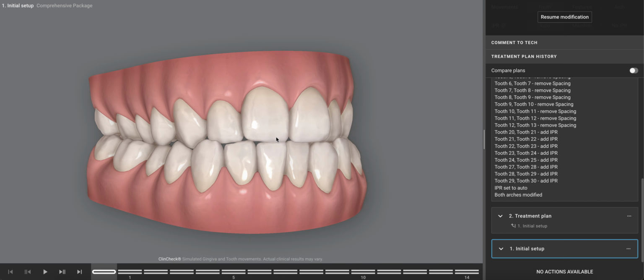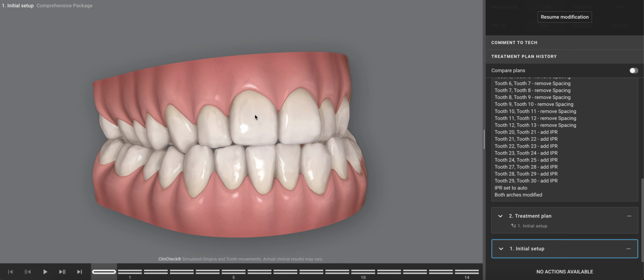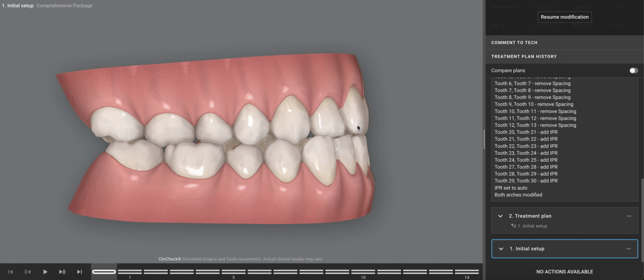And before we start talking about solutions, let's talk a little bit about diagnosis. Without a question, there's an interarch discrepancy. There's a transverse discrepancy here where the upper arch is constricted. Posterior crossbite might be another way to describe this, most likely due to inadequate development of the maxilla. It's pretty obvious here that that's definitely part of the case.